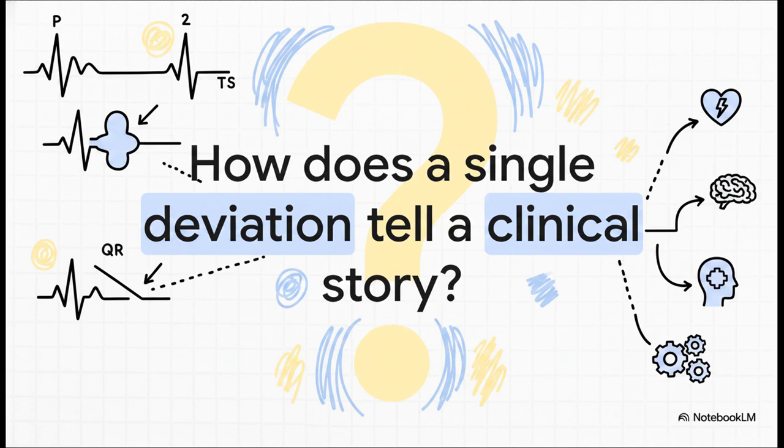This framework isn't just a tool for interpretation. It is the absolute foundation upon which sound clinical judgment is built.